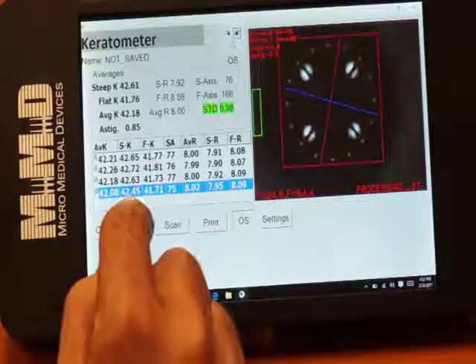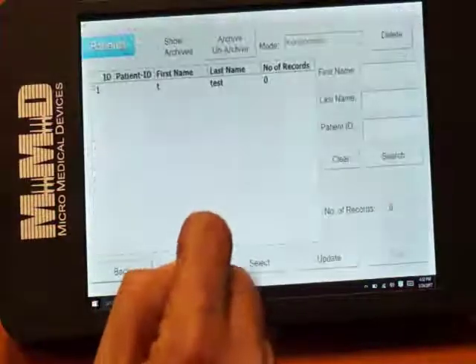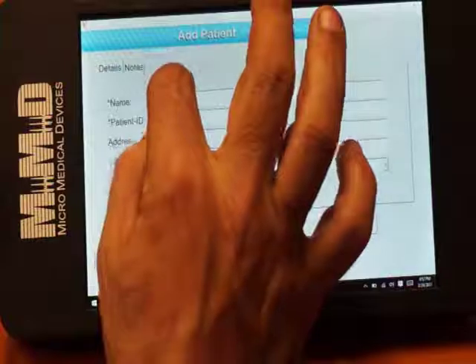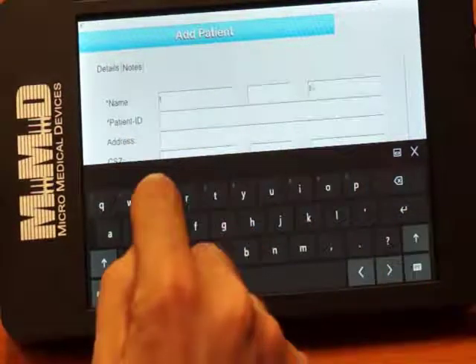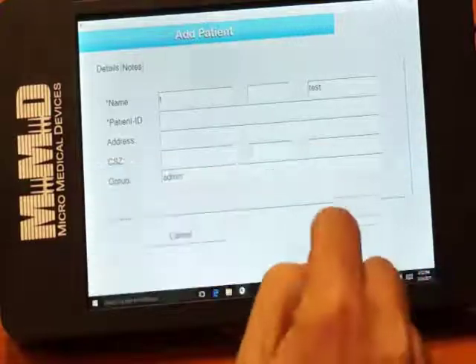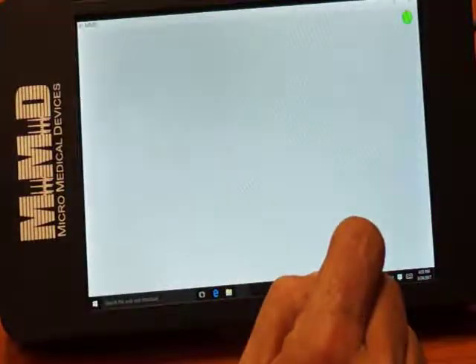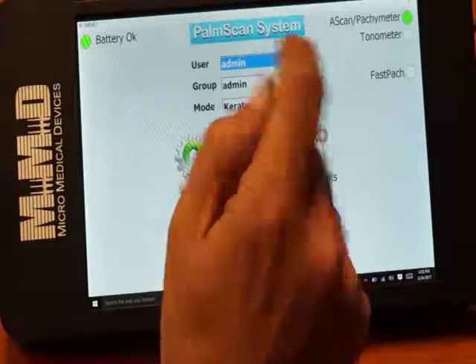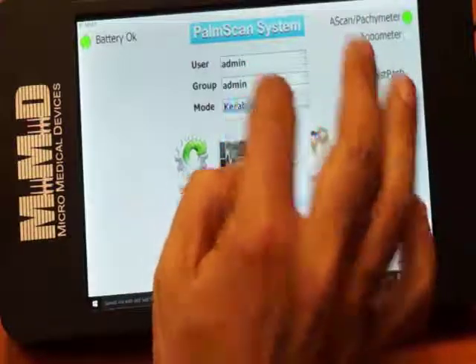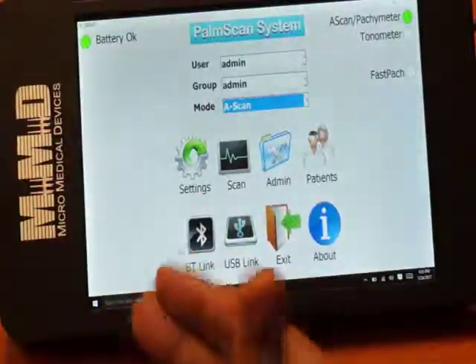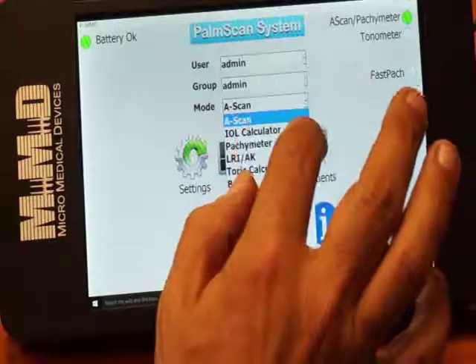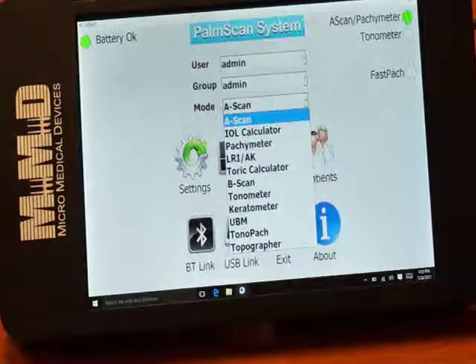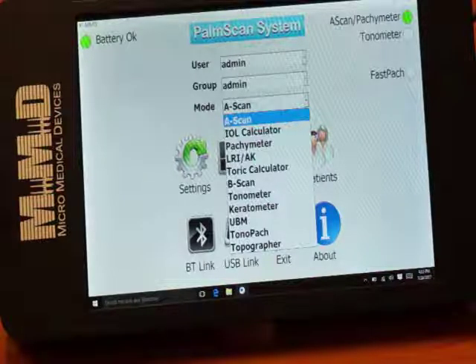At this time you save the patient and add it as a new patient — we're going to call him test. So now you can use the same machine, select A-Scan, and do the A-Scan. Then you go into your IOL calculation and the results for the keratometry will automatically be imported into your IOL calculator.